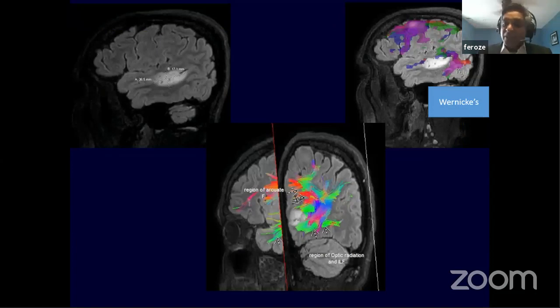So I will leave you with a figure here. This is something that just came out last week from one of our studies at Jefferson, using traditional, commercially available software, combining DTI and fMRI. So on the language mapping, I think the patient had seizures and enhancing mass and non-enhancing lesion components along the superior aspect of, I think, the left middle temporal gyrus.